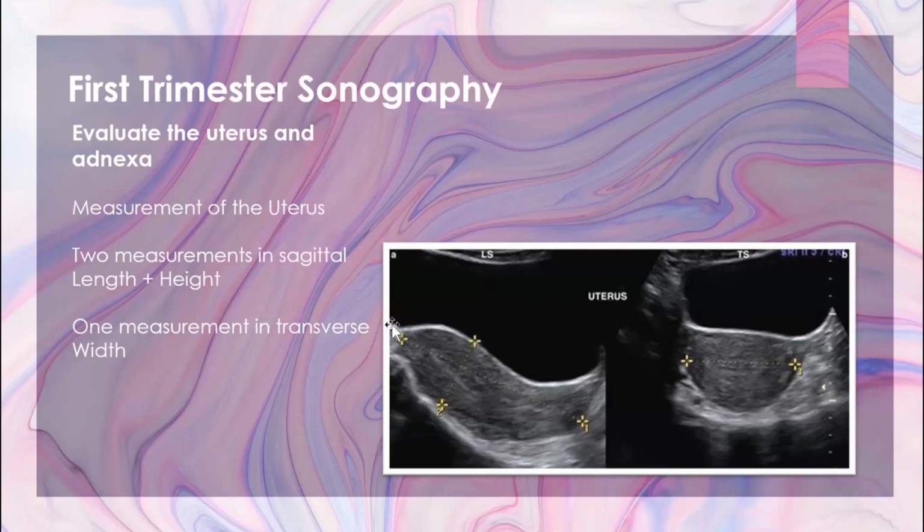That's definitely helpful in really early pregnancy to see the gestational sac. It's not necessarily required, but if you have a patient with larger body habitus, it's helpful. And then if it's not helpful to you, just have the patient void and then image again. It can't hurt. One thing the bladder is helpful for whenever you're new to scanning is knowing that you're scanning low enough on the patient's body to get to the uterus. So it can be helpful there.